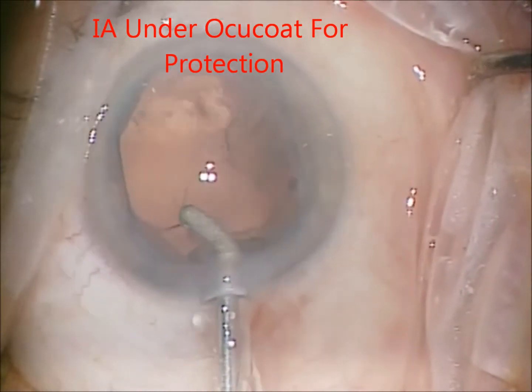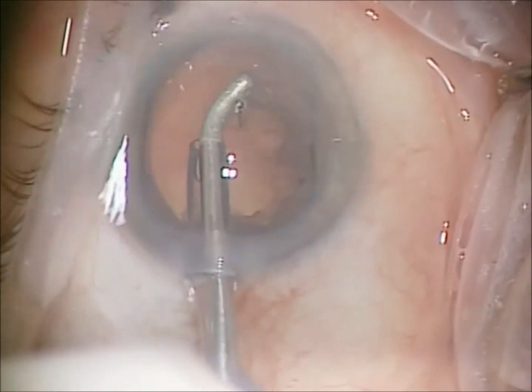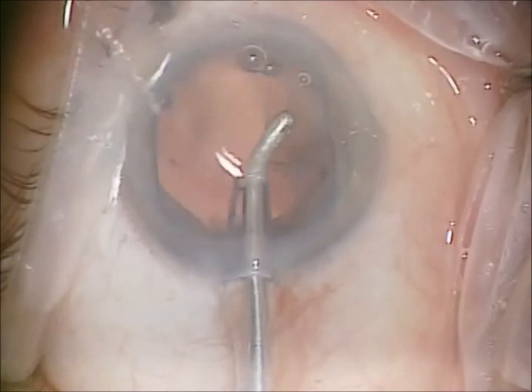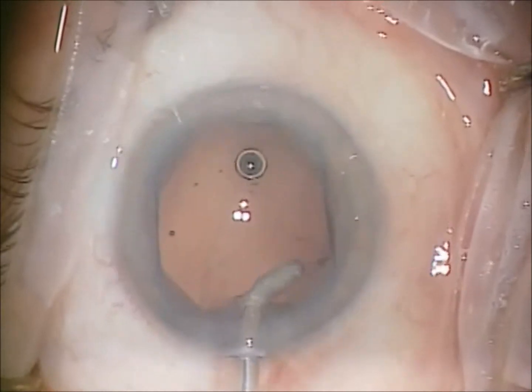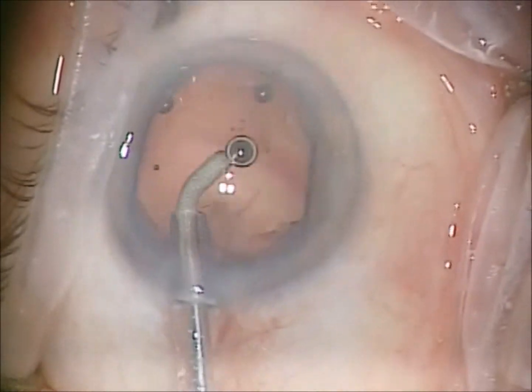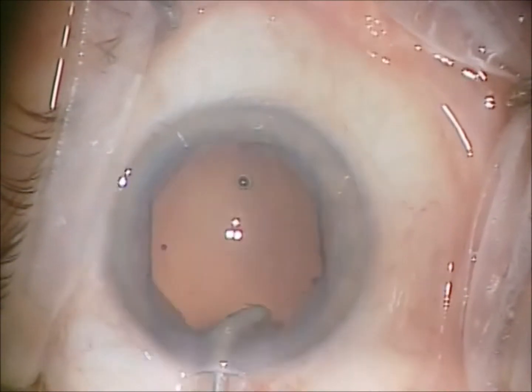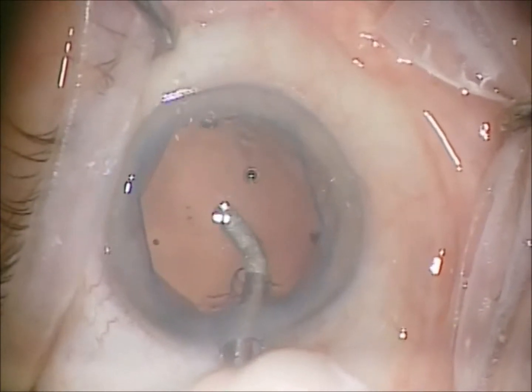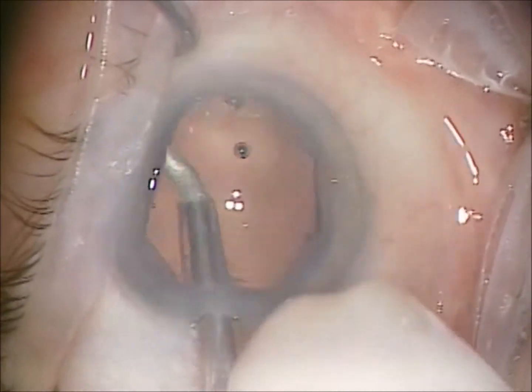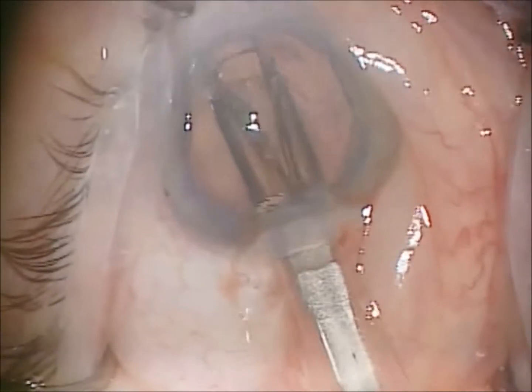I continually re-added viscoelastic to help protect the corneal endothelium. Prior to starting irrigation aspiration, OcuCote was instilled into the anterior chamber, for a little protection without inhibiting the removal of cortex.